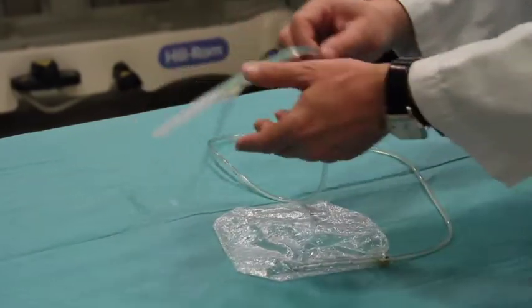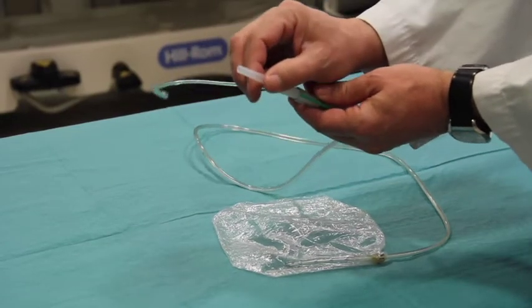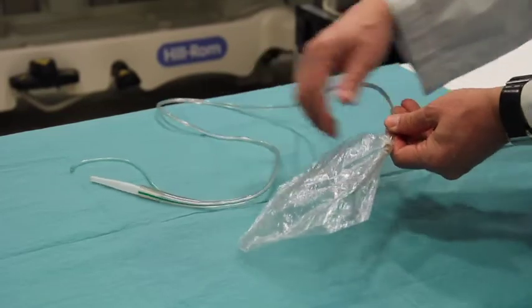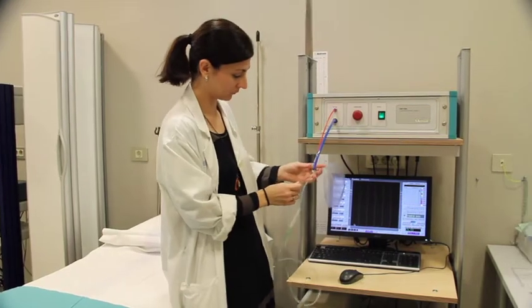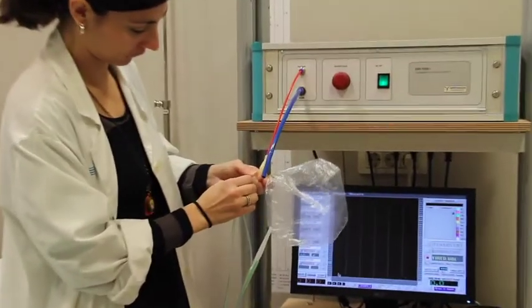Here you can see the double lumen tube and the bag connected. The tube is connected to the pressure sensor and the other one to the balloon pump.